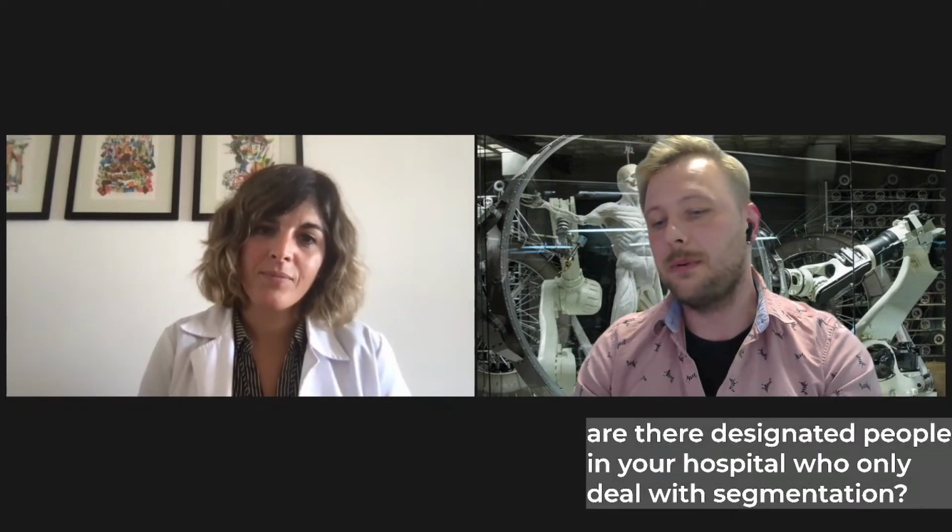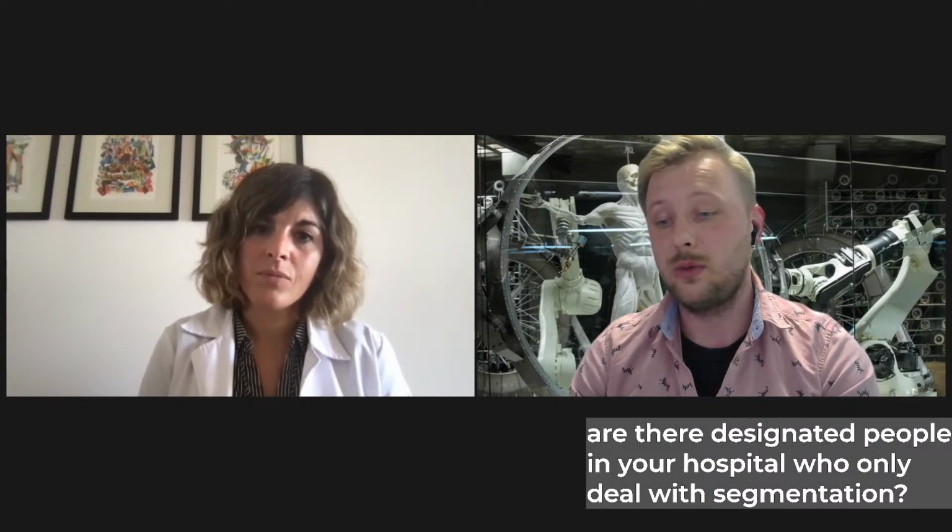Great. Okay, I hope that was what he wanted to know. Another question from Paul Ozga from Poland. He's wondering, are there designated people in your hospital who only deal with segmentation?